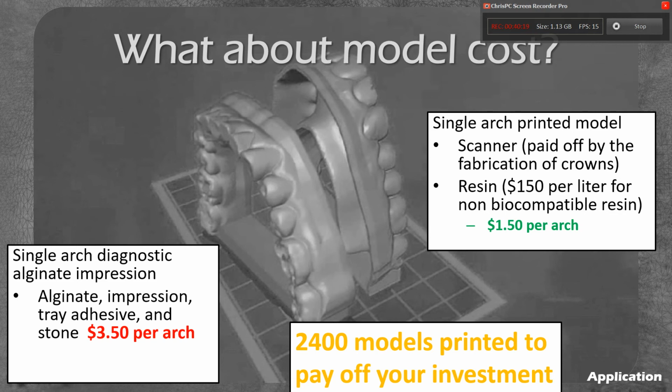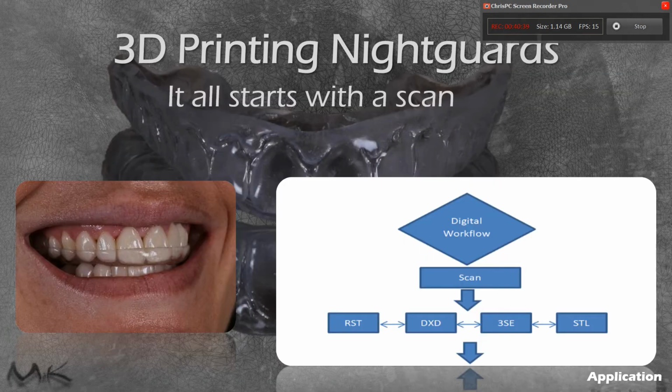So even though this is a great way to start on 3D printers, this isn't where you should stop with your 3D printer. This should maybe be what gets your feet wet and gets you used to the 3D printing process. But I'm going to show you some methods that we can actually reduce that return on investment down to as little as 6 cases on our 3D printer.